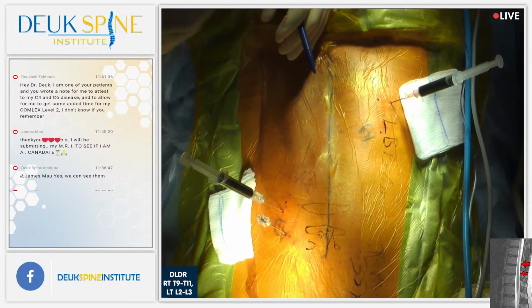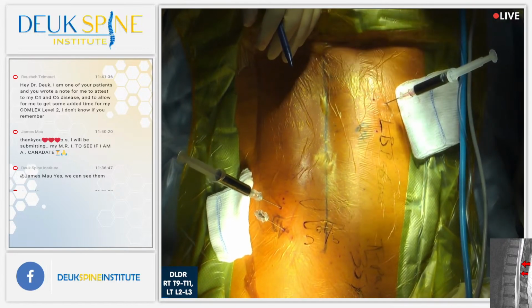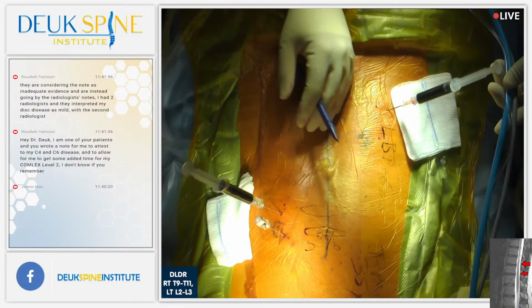Don't move around so much. So I injected a little bit of dye in that disc, and just that little bit of dye, about a cc, has made him very uncomfortable. Lay still. That pain's going to be gone when we're done with your surgery. Lay still.